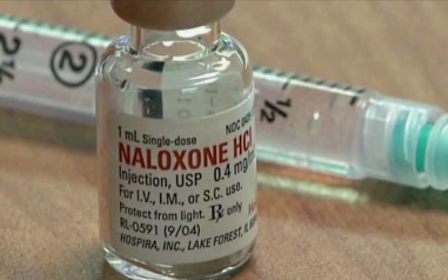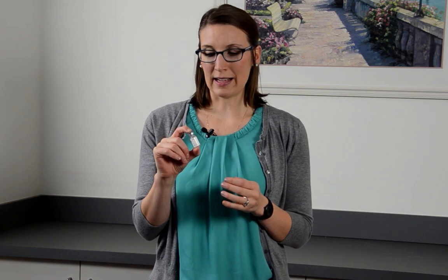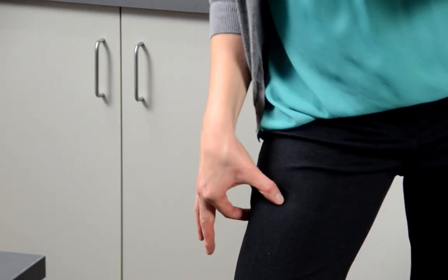So you've called 9-1-1 and grabbed your naloxone. Now what? Injectable naloxone comes in a one milliliter single-dose vial, similar to this one, and it can be given intramuscularly in the patient's deltoid on their upper arm, their quadriceps on the outer aspect of their thigh, or their gluteal muscle on the upper portion of their backside.